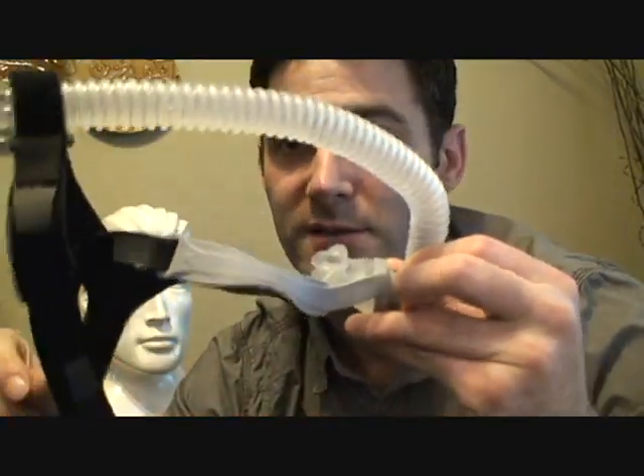Hey, my name is Jason. I'm a registered sleep technician and I just wanted to go over the Fisher Paykel Opus 360 nasal mask. First, let's go over the fitting — here it is completely assembled, looking the way it should be out of the box.